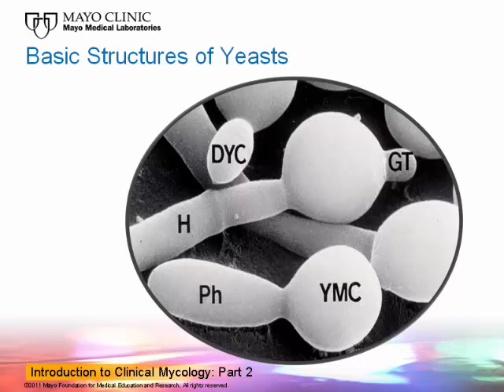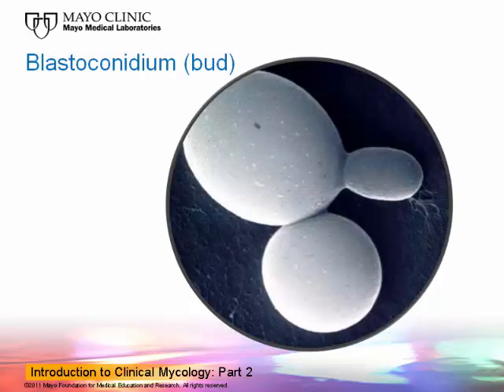And we use a germ tube as a means of trying to identify Candida albicans. If you look on the left-hand side, you'll see there's the elongated cell, a hyphal strand. It's a hypha. So you see these structures with yeast, and as we go along, maybe you'll see some of these.